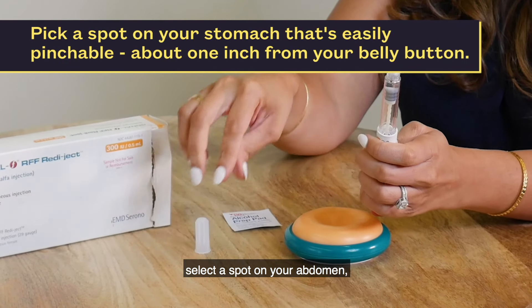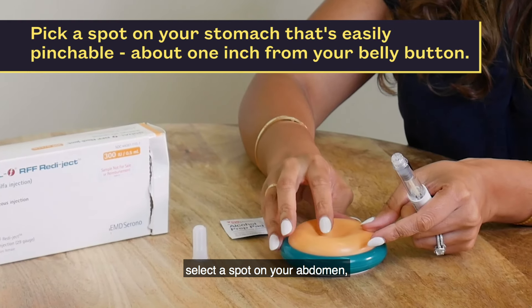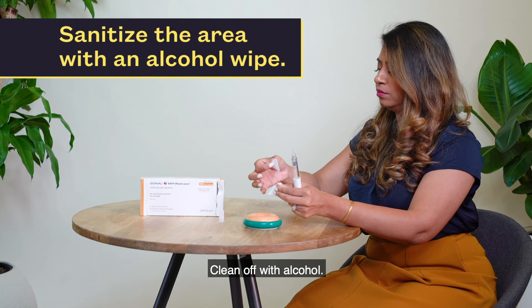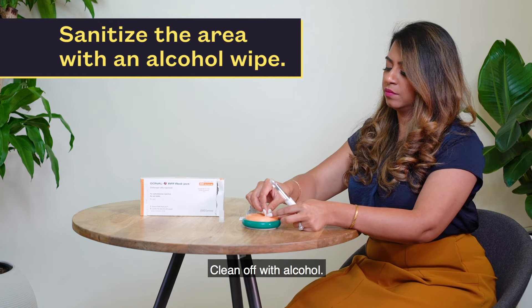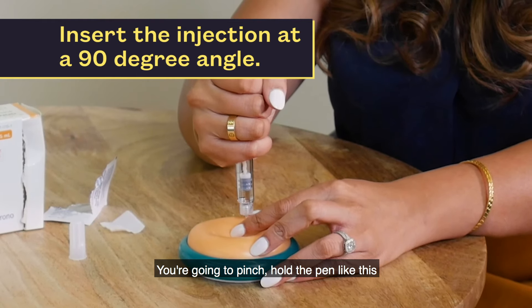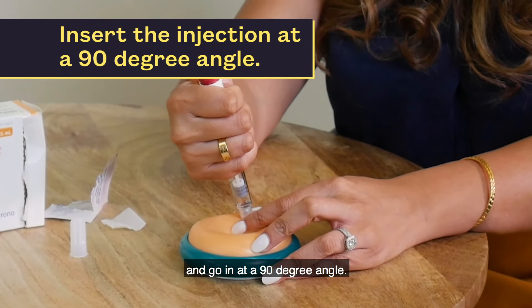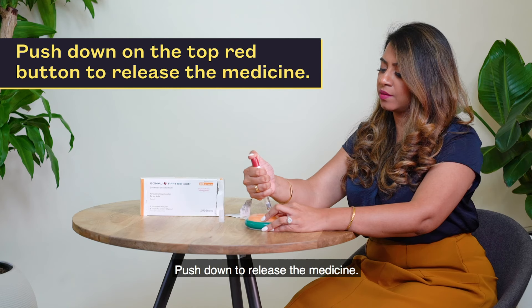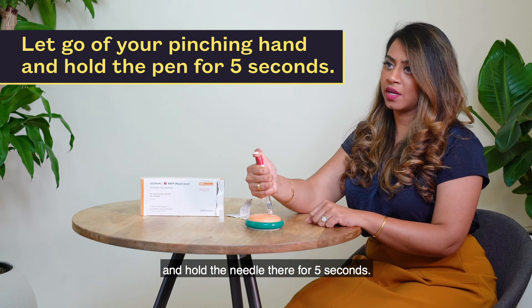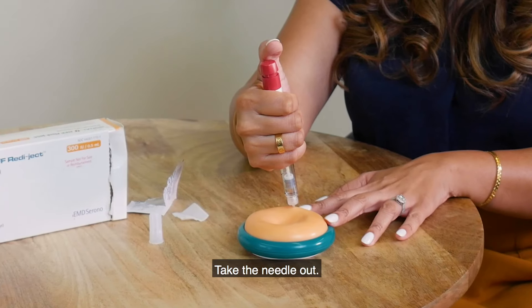Select a spot on your abdomen that is one inch or more away from your belly button. Clean off with alcohol. Pinch and hold the pen in your hand, and go in at a 90-degree angle. Push down to release the medicine. Release your hand that's holding your belly and hold the needle there for five seconds — one, two, three, four, five. Take the needle out.